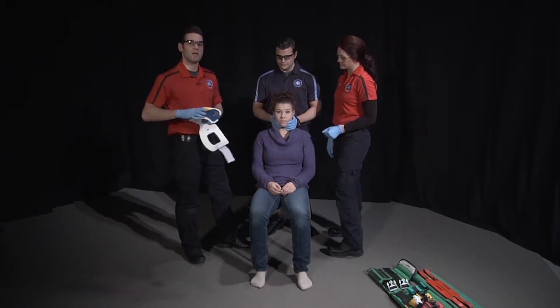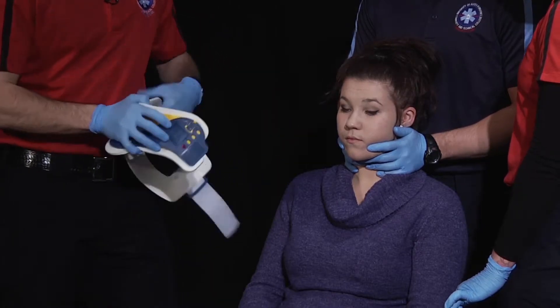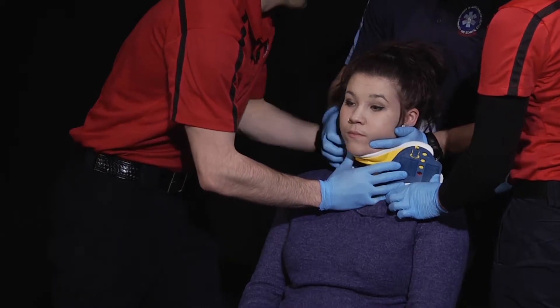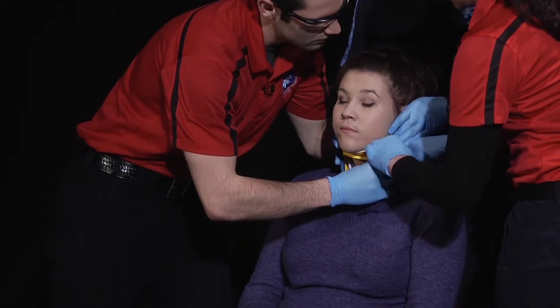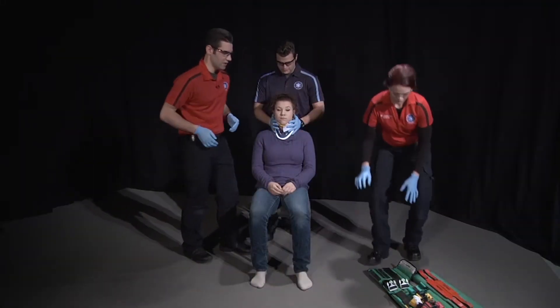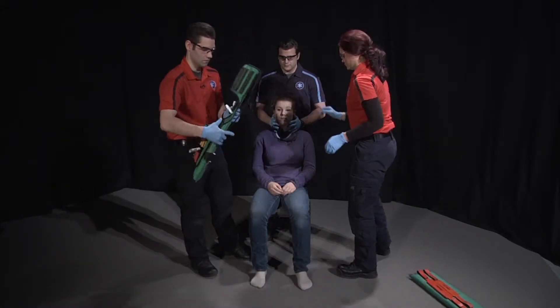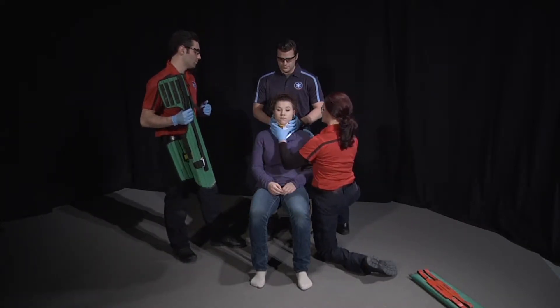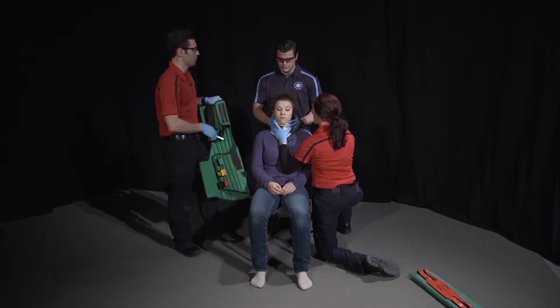Then I'm going to measure and apply an appropriately sized C-collar. Then we'll get our short spinal immobilization device. I'm going to have my second partner hold on the torso, and on the head's count we'll move forward and position the device appropriately.